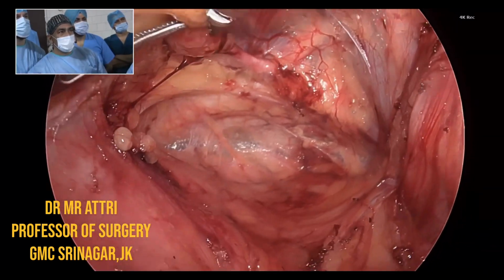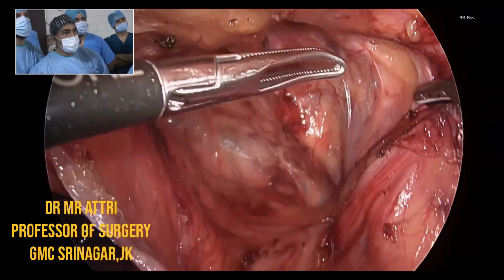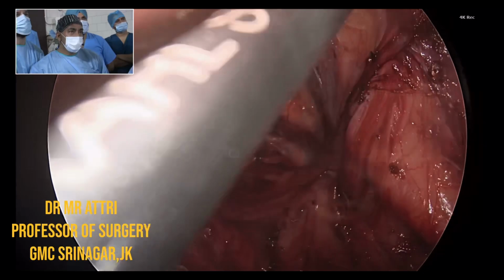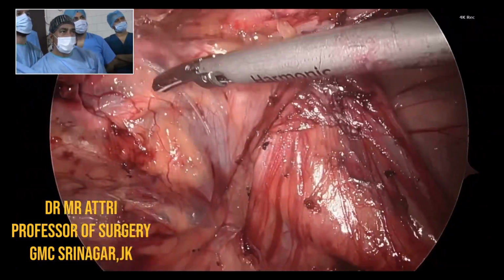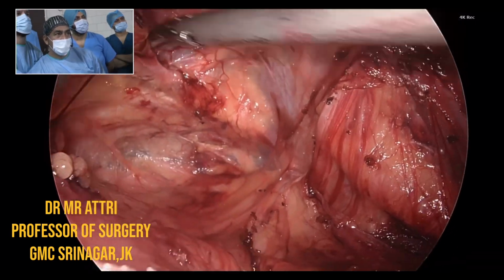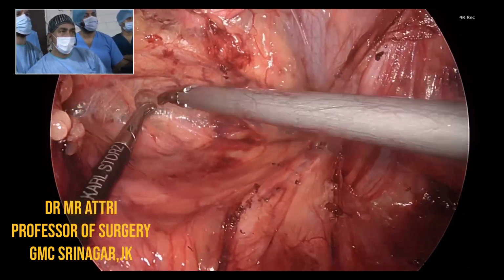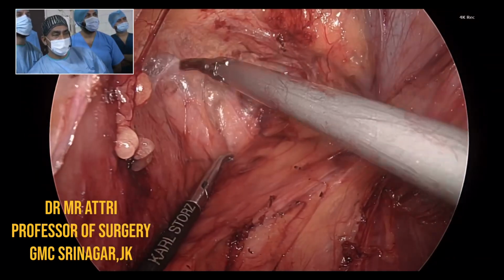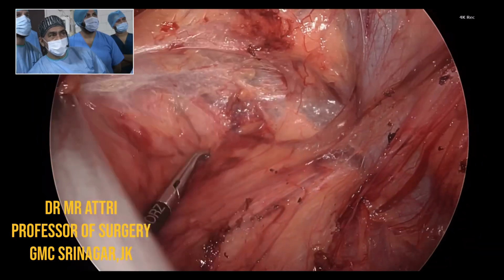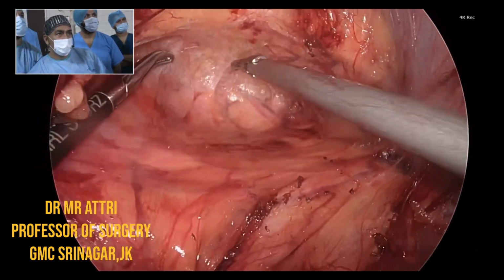So this is the direct defect. This is the lateral edge of the rectus muscle. This is the inferior epigastric vessel, and this is the inferior epigastric vessel, and we have dissected the pseudo sac. It has gone down. So we have dissected the right-sided Cooper's ligament. We are into the cave of Retzius, or space of Retzius. We have already dissected the space of Bogros laterally. We have made adequate space for placement of mesh.